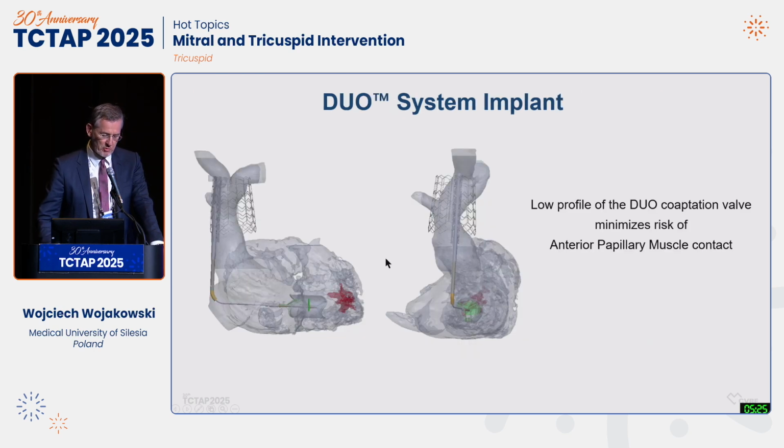So this is pre-planned with a CT, and this is crucial, what we learned from early cases. The stent should be oversized by 30 to 50%, the anatomy of the SVC plays a role, and this CT should be done in a patient who's not completely dehydrated.